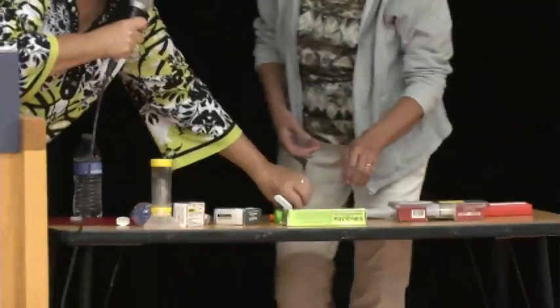Now there's a little bit of differences to the two. Remember, the full-size EpiPen is hold for 10 seconds. The AviQ is 5. It counts for you. As you can see, it's a little bit shorter, so it doesn't take as long for the medication to be administered. It also has a more sensitive spring-loaded mechanism, so you don't have to stab and jab. You place this on the thigh and press firmly.